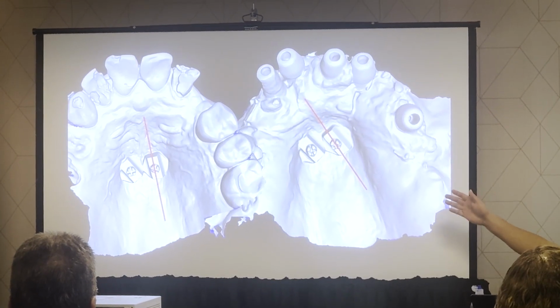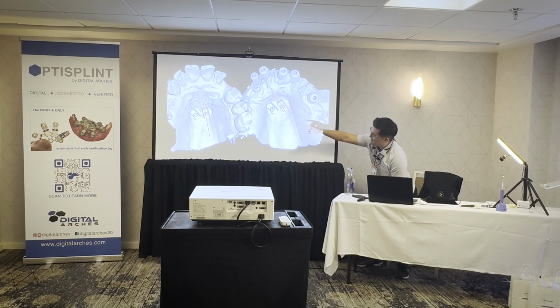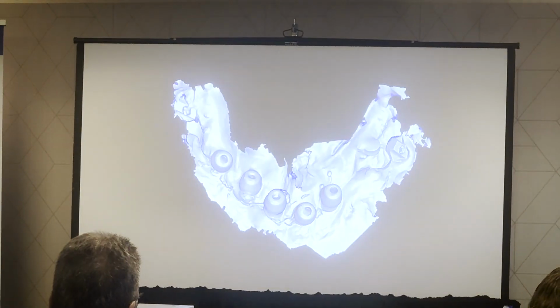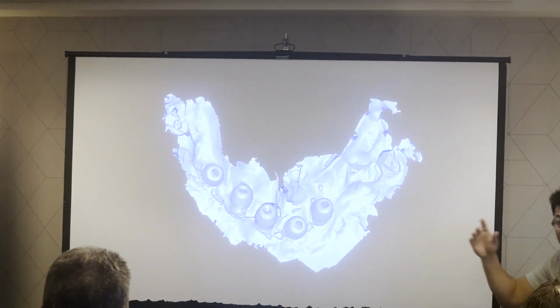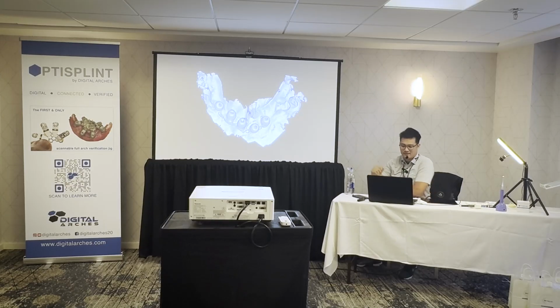So I've never seen that happen. I've never had one move before. But we had one. And then the problem was that we didn't get a great scan. There wasn't a lot of geometry left on that. And so I'm like, okay, let's try to use the one. And then he's like, we had another problem. I'm like, what? On the lower right? You only got a couple here. Look at that on the bottom right side. It's very challenging to get these scans, capture that information.